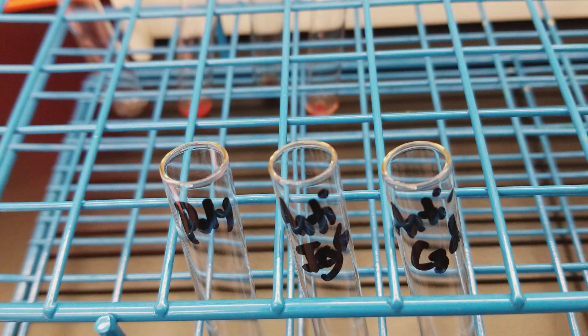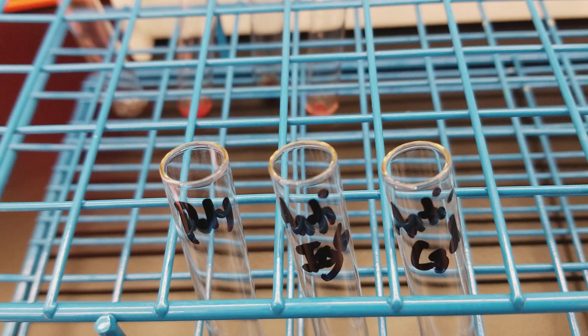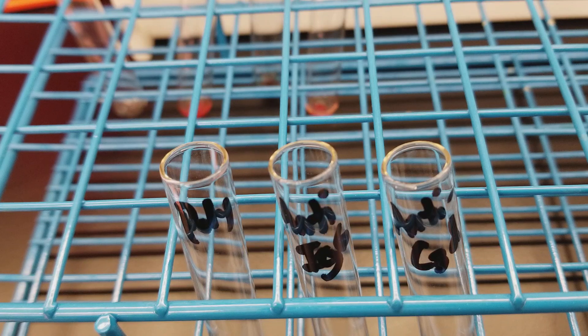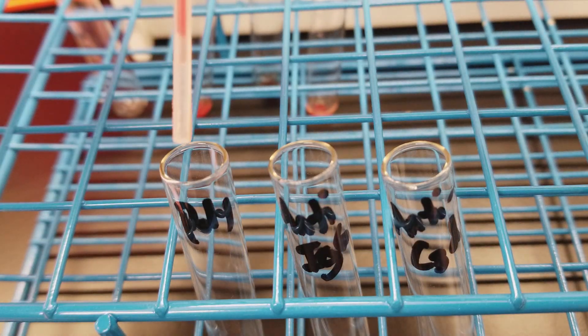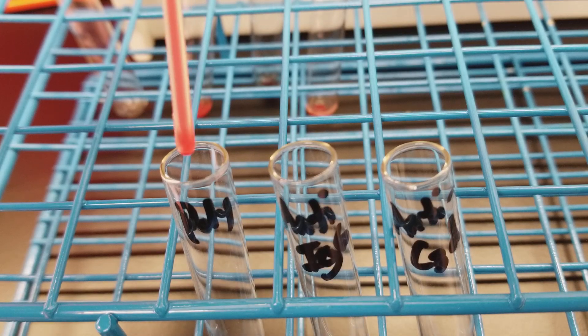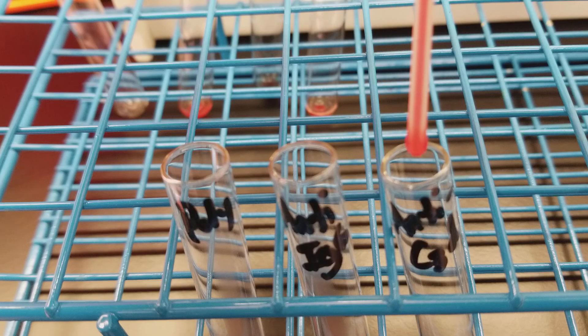I am going to add a drop of my patient's three to five percent cell suspension to each of those tubes. So we have one drop, one drop, one drop.